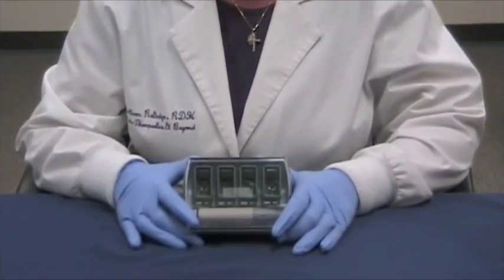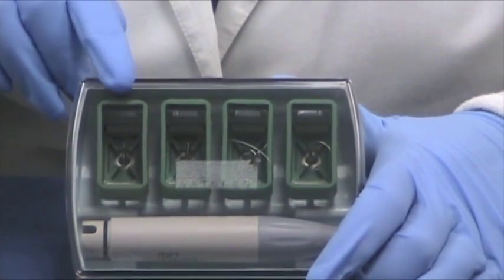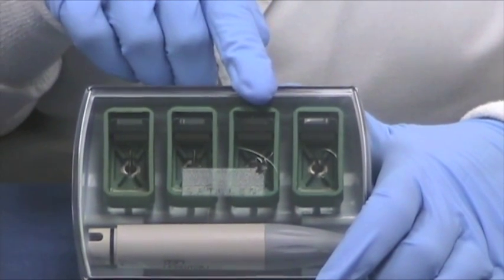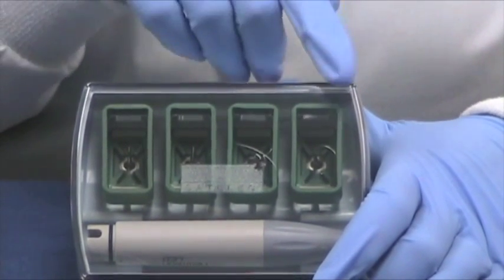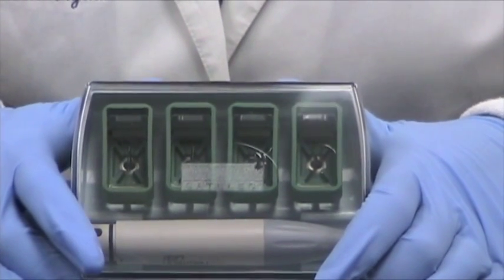Hi, Colleen Rutledge here again talking about the Biofilm Disruption Kit. The Biofilm Disruption Kit includes four tips: the TK-1-1S, the TK-1-1L, the TK-2-1L, and the TK-2-1R. They're all at the green mode and the low power setting.